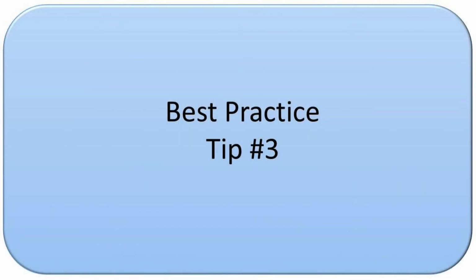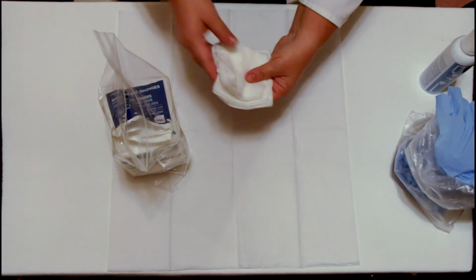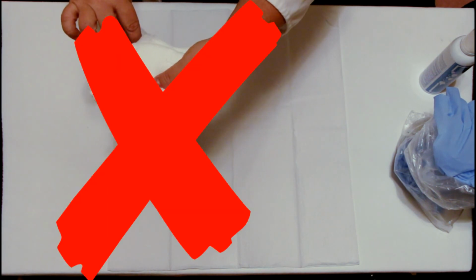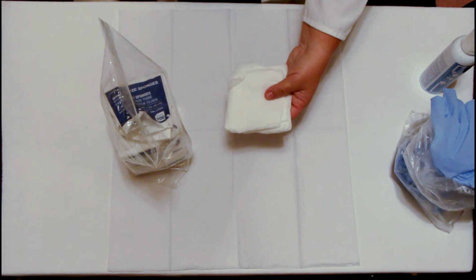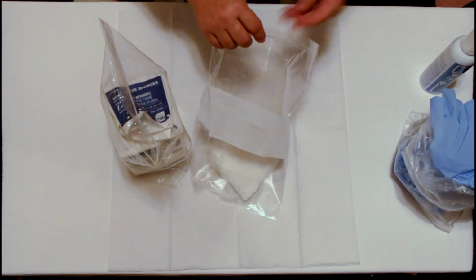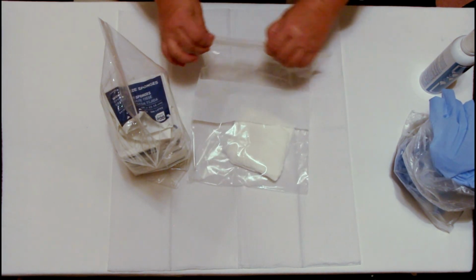Best practice tip number 3. Never return unused bulk gauze to the original package. You may place it in a separate baggie as long as it is not contaminated for use at a future visit. But if in doubt, throw it out.